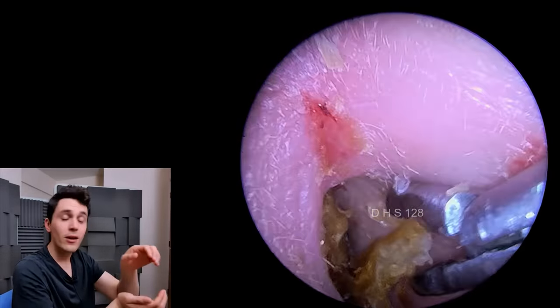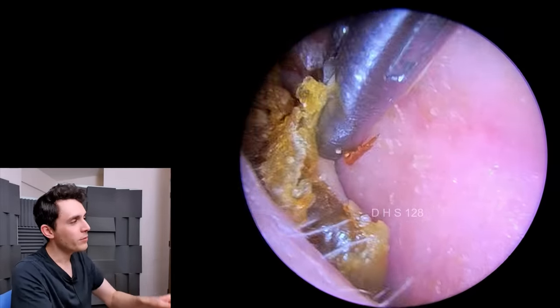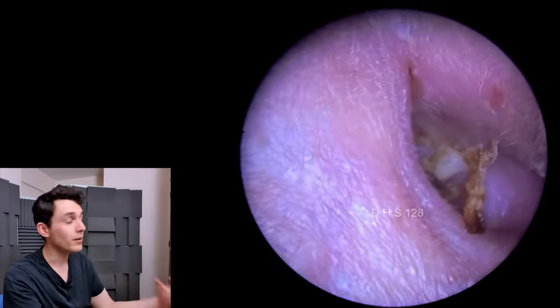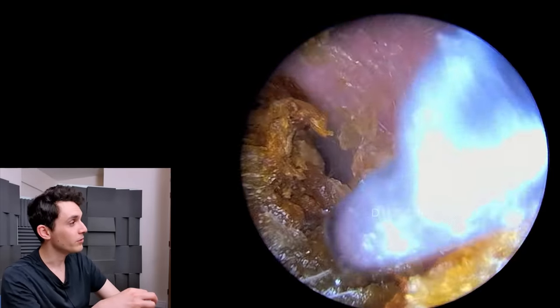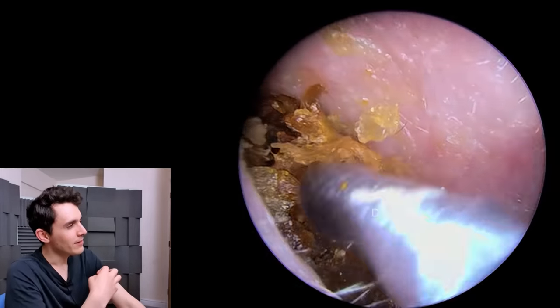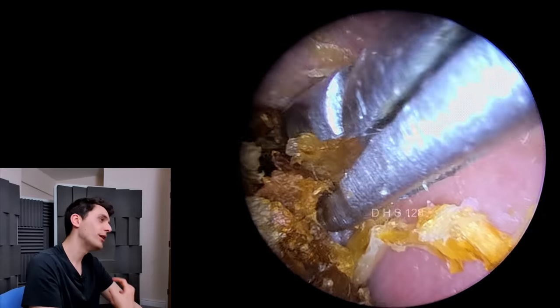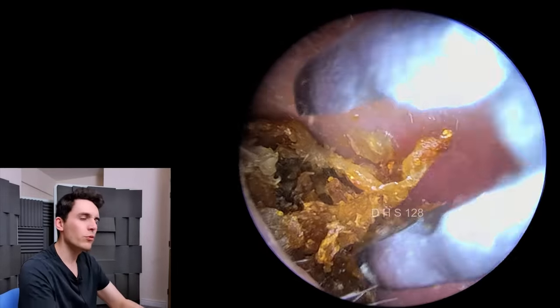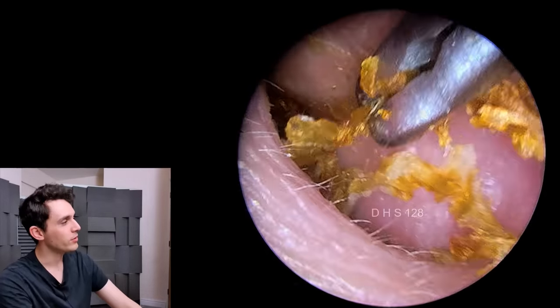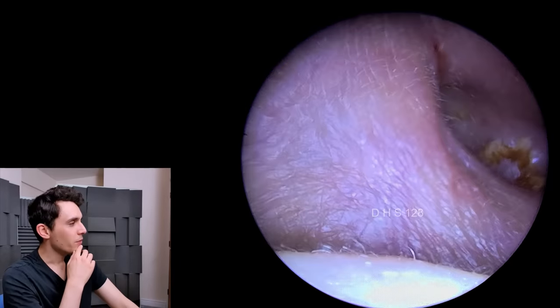They have sort of shallow depressions in each jaw. I thought that would be wonderful because it'll allow me to grab onto debris and maybe that debris won't just rip apart like when you grab something with crocodile forceps. But they're not actually that good — they're far too large. Like most forceps on the market, they really are too large, and the jaws don't close properly, which is really annoying. What you're going to see here is just a complete failure to use the biopsy forceps. So that didn't work — we're going to go back in with the hook.